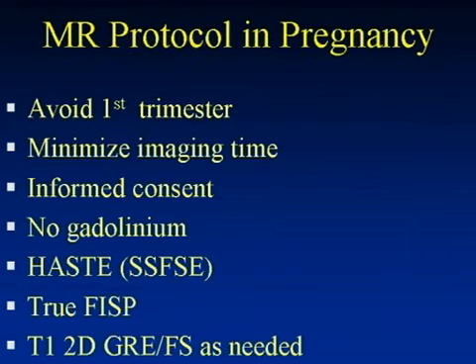So our MR protocol in pregnancy, we avoid the first trimester. Again, this is a time of critical organogenesis, and we do really try to minimize the imaging time. You want to decide what question you're trying to answer and then target your examination appropriately. We do obtain informed consent.